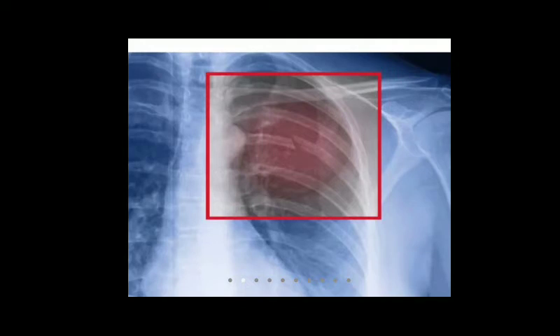There is an obstruction of the great vessels due to lung collapse with shifting mediastinum that impairs venous return and finally decreases cardiac output, and the patient may lead to cardiac arrest and death.